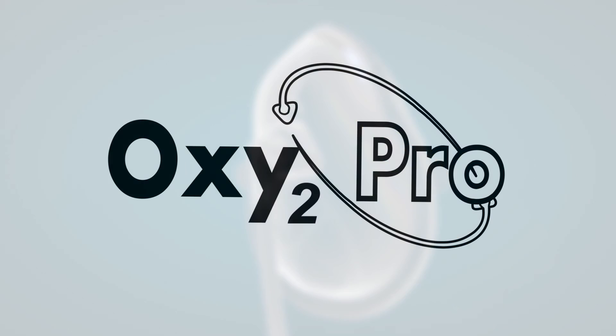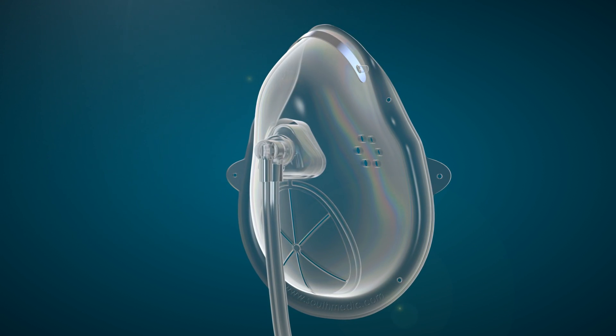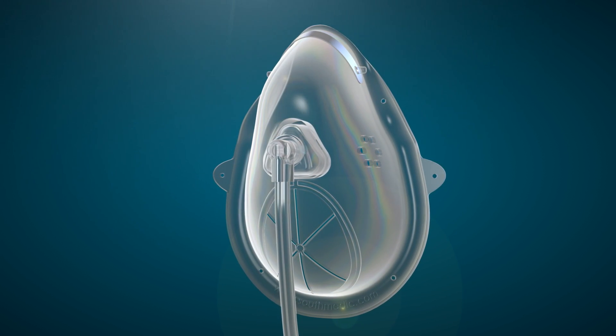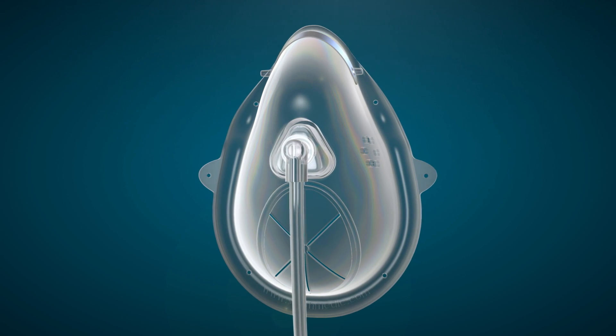Introducing Oxy2 Pro, the revolutionary procedural mask from South Medic that is able to provide easy oral access for endoscopic procedures at the highest FiO2s in its class without compromising end-tidal CO2 capture.